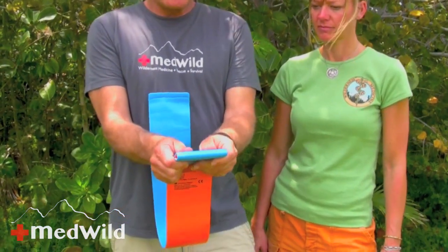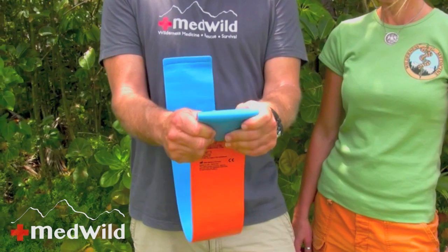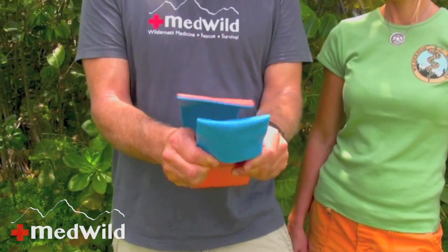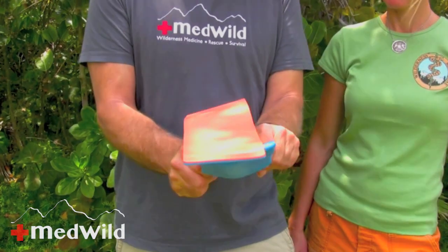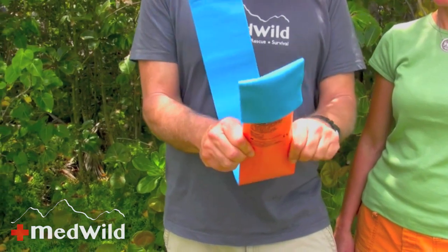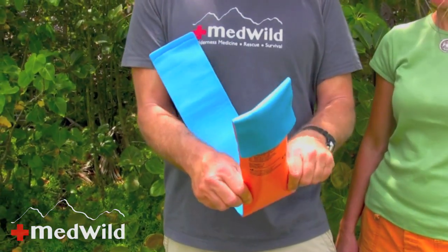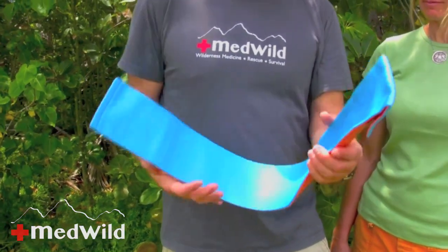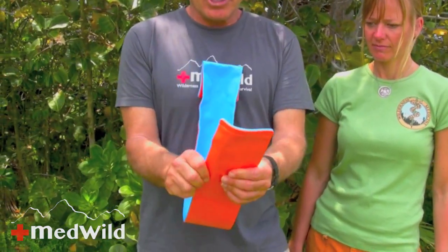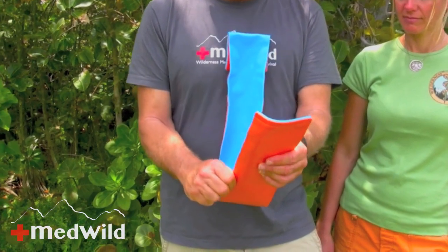The next thing I'm going to do is put those really important structural bends in. In this case it's going to be a simple C bend, which looks like — a C. As soon as I start putting these bends in, I get that structural rigidity that's really important. I usually bend it about two-thirds of the way down Denise's arm on each side, and I leave the elbow portion somewhat unbent so I can mold it around her elbow at the end.